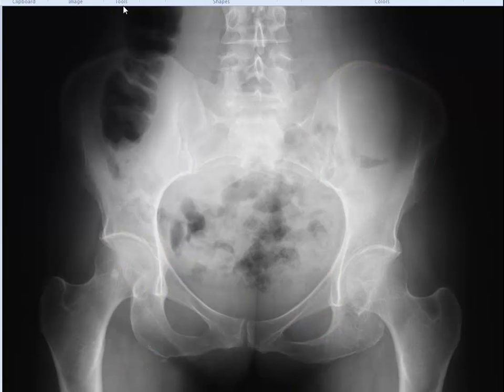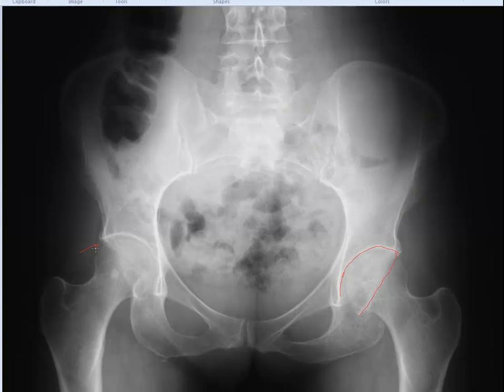Let's continue with the acetabulum. The acetabulum is a socket — a three-dimensional structure — and we're seeing it on a two-dimensional medium. Here's the margin of the acetabulum medially and anteriorly, and here's the posterior margin of the acetabulum, so it's a very cup-like structure. This is the femoral acetabular joint. We assess three portions: the superior most portion, which is prone to joint space narrowing secondary to degeneration as it is the weight-bearing portion; the axial portion; and the medial portion.